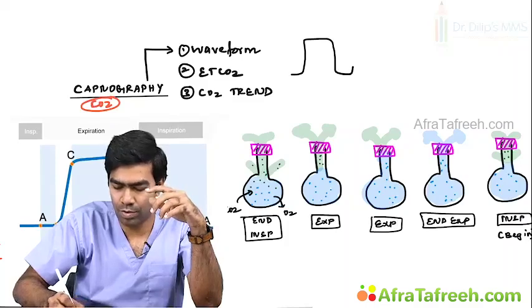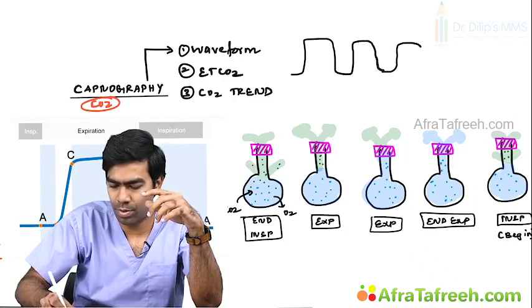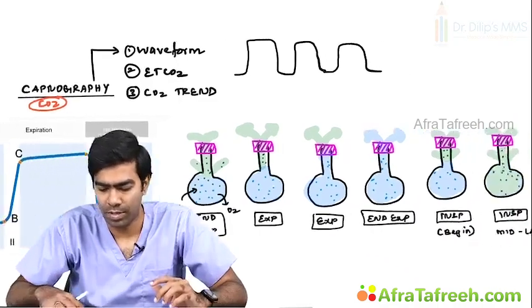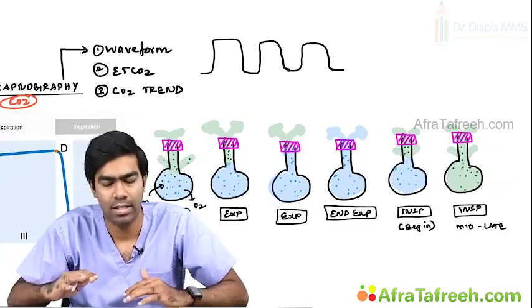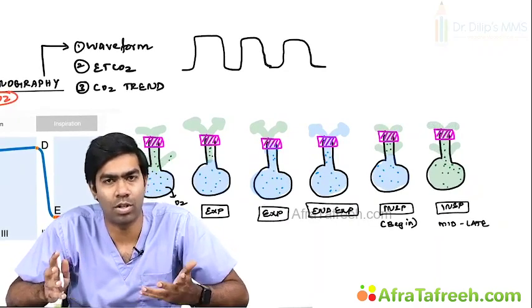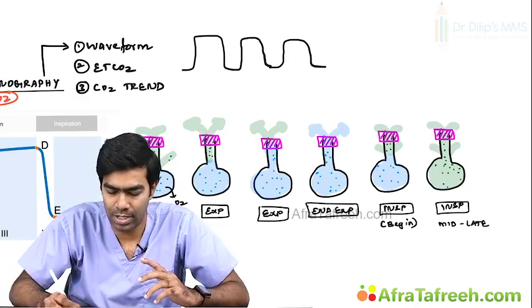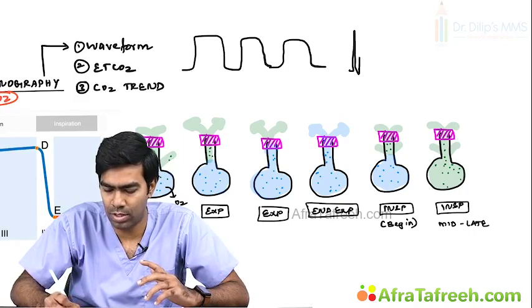So for example, let me draw you two waveforms now. Probably these are the three waveforms. Even though I have intentionally drawn to show that they are decreasing in their size, but in real time, it may not appear as if they are decreasing. They might look almost the same. So when you see the trend, they will compress all the waveforms together.